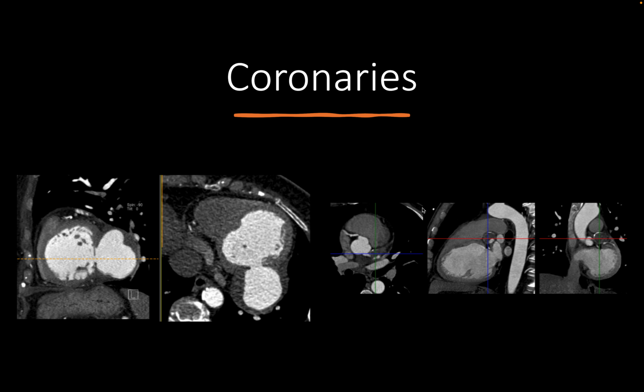Not only that, but sometimes a severe coronary artery disease leads to a myocardial infarction with severe complication, for example, in this case, an aneurysm coming out of the left ventricle. So that is a short axis. We could see the right ventricle, and that is the left ventricle with a massive aneurysm.